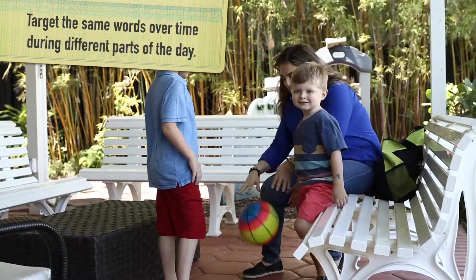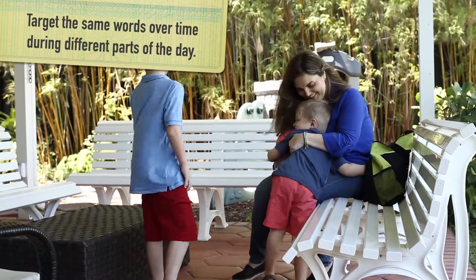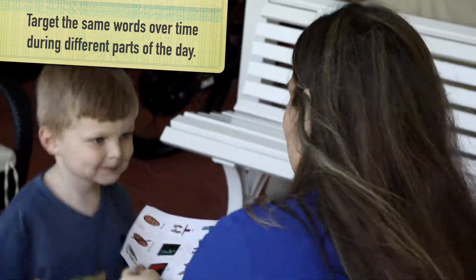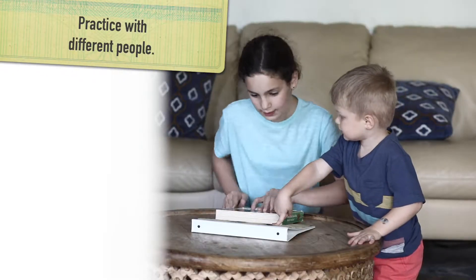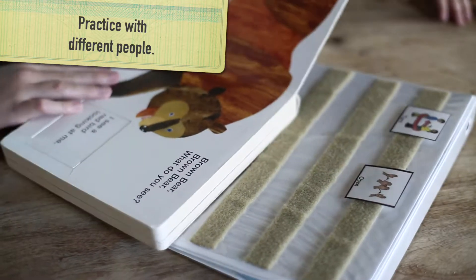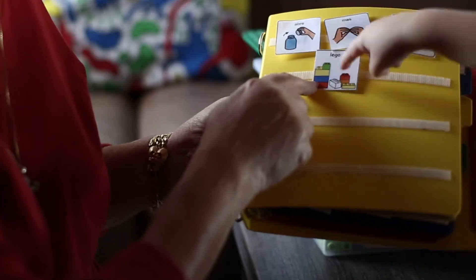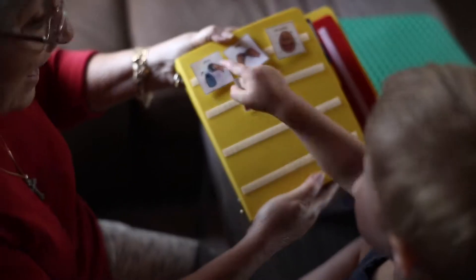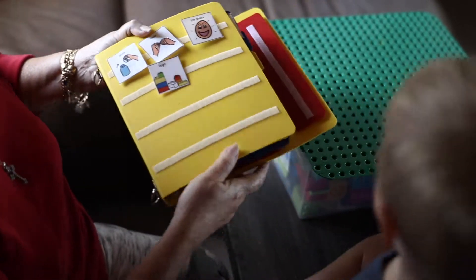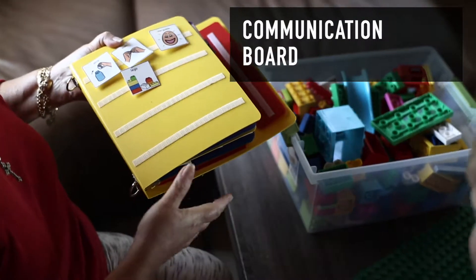Continuing to target the same words over time, during different parts of the day and with different people, will help build Dylan's understanding that he has the power to communicate with others in an intentional way. Now it's Grandma's turn. While building Legos, Dylan and his grandmother use a communication board.